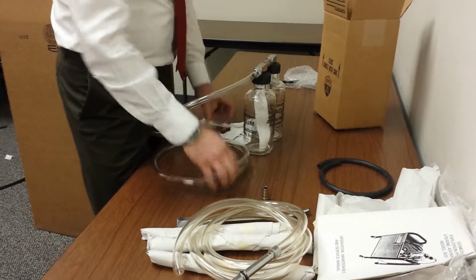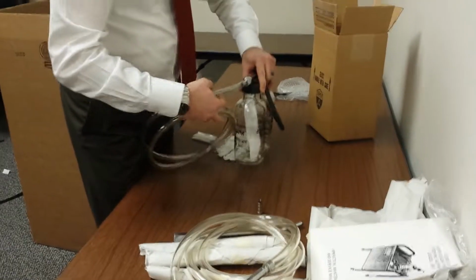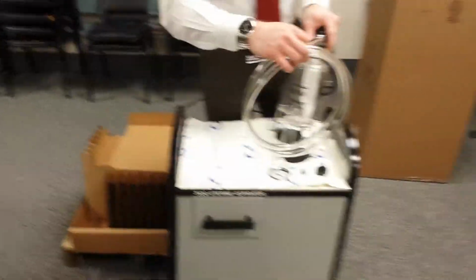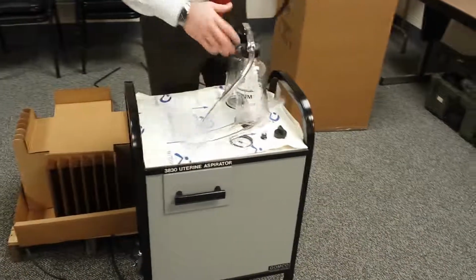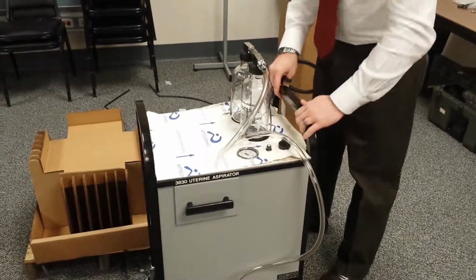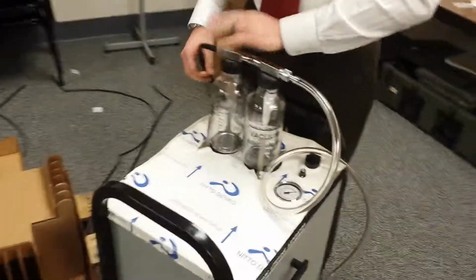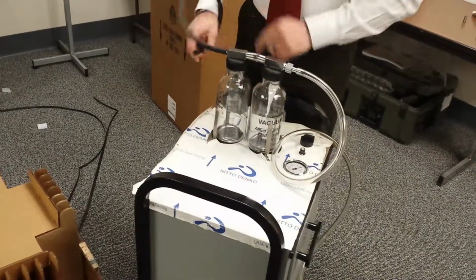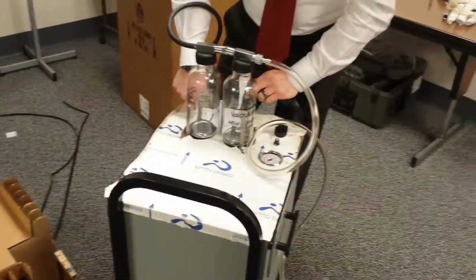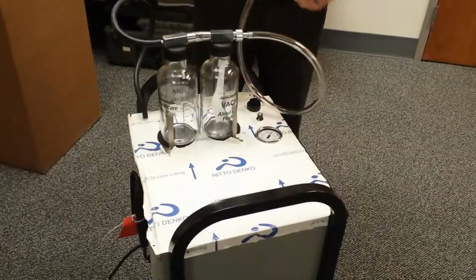Now, regardless of which system you use, the next step is putting the bottle collection assembly onto the unit itself, and that's a simple matter. You simply place the bottle assembly in there. You'll note that we have this short black tube. If you come around here, you'll see that one side will attach to the inlet to the bottle assembly, and the other side will attach to the outlet, or the pump outlet, which is right here. That's your vacuum source. Once you've done that, the bottle assembly is set up.